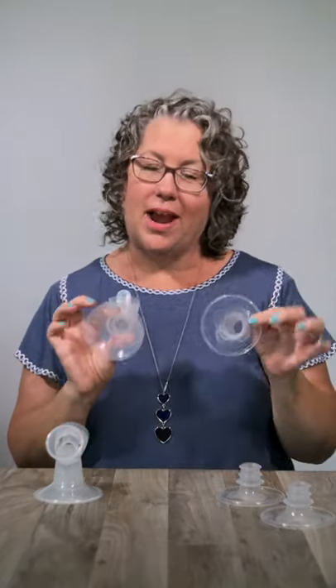The one that comes attached to your pump has an insert. Right off the bat, this gives you two choices of flange sizing.